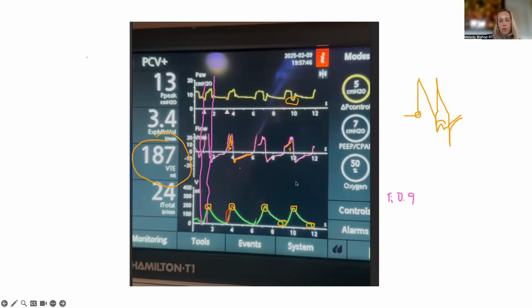But it brought up a couple really good avenues to chat about, like the amount of support we give patients and sometimes the implications of lowering that support. And also a great conversation regarding reverse triggers specifically, recognizing them and things to watch for with sedation levels. They were able to decrease sedation and remove the reverse trigger, and work through trying to synchronize as best they could with the neurodrive they had. So it was the right milieu, meaning there was a lot of sedation on board. Yes, exactly.